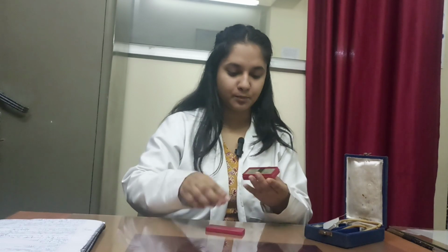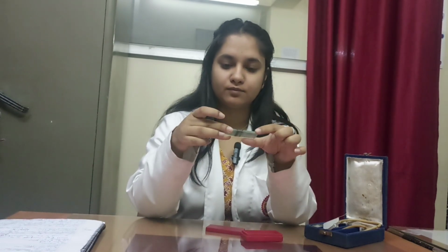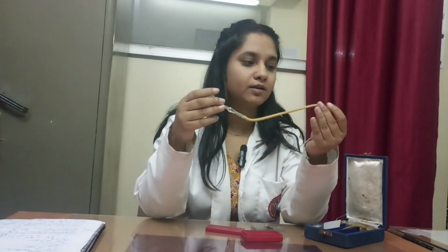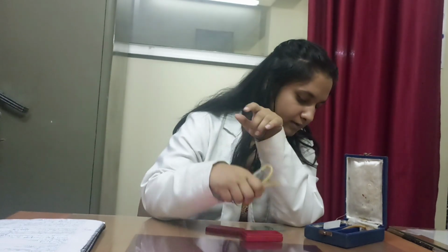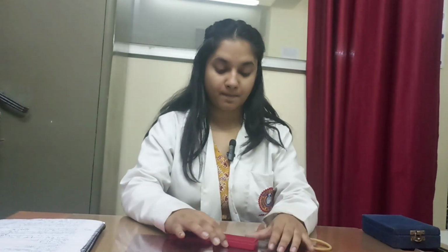This is the improved Neubauer chamber. This is a WBC pipette. The mouthpiece, bulb and the readings are present. This is the stem part of the WBC pipette. These are the instruments which we require to perform the practical.